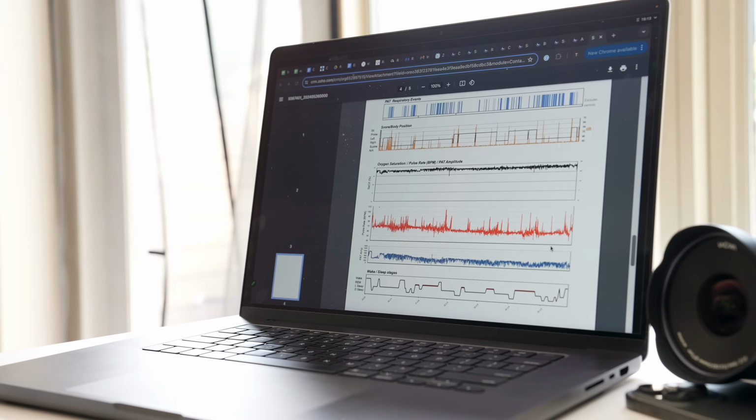This is going to be like a visual of what you did. So this first row, this is all of the respiratory events you had, just showed you how often you had those. That orange color, that's going to be any snoring or any sounds that you may have made in your sleep there.